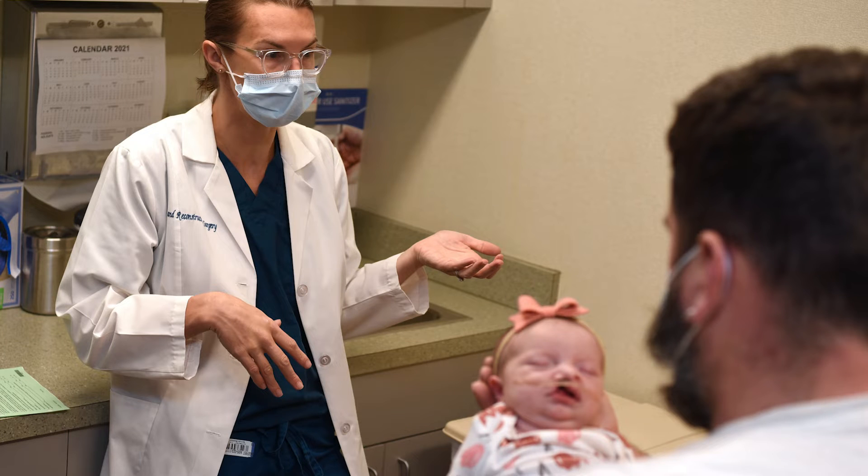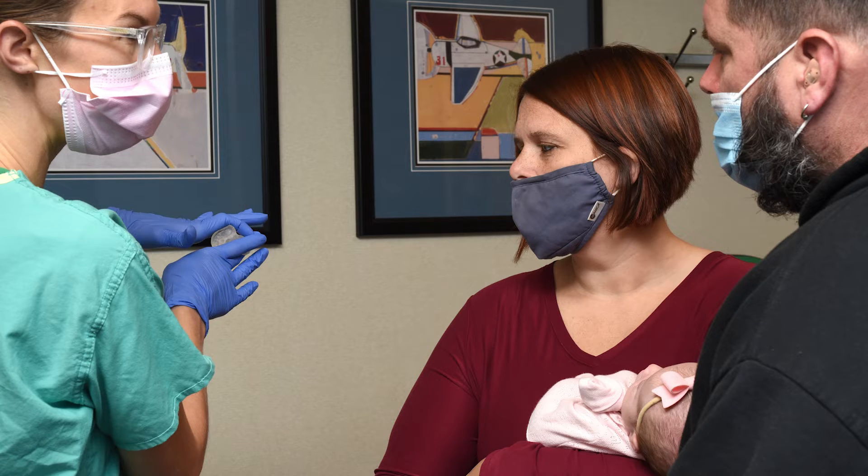Hi, my name is Kate Lambert, and here we're going to talk briefly about the naso-alveolar molding appliance as we walk through an early-stage appointment with one of our sweet patients and their family. The NAM is a pre-surgical therapy completed by a specialized dental professional, in this case a pediatric dentist, which helps to gently narrow the cleft and improve the shape of the lips and the nose in preparation for surgery.